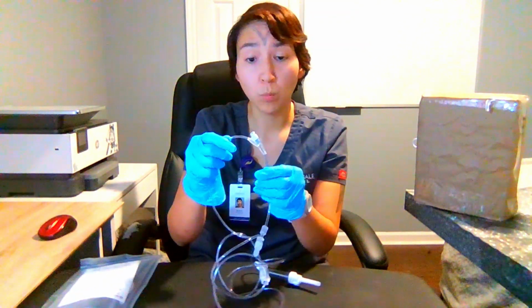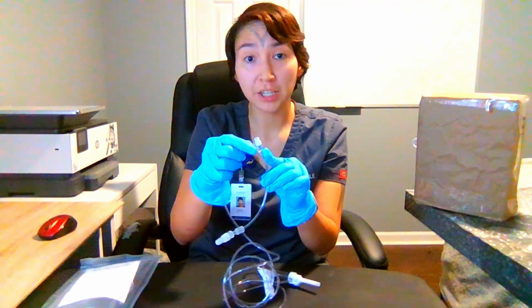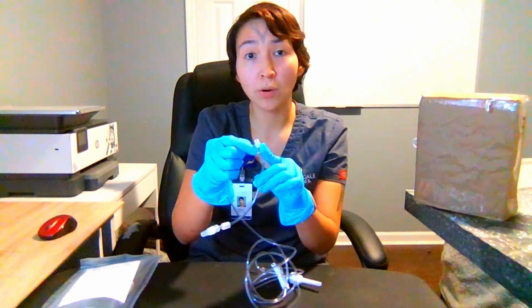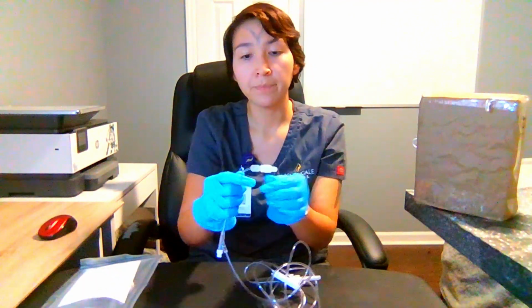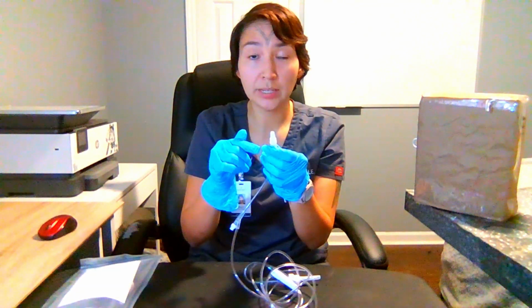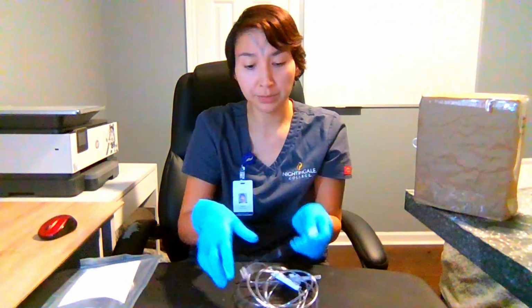This is the Y site. This is the port where medications can be administered, either push medications or a secondary line can be connected to it. And this is the adapter end. This is where it connects to the patient's IV catheter to allow fluid administration.